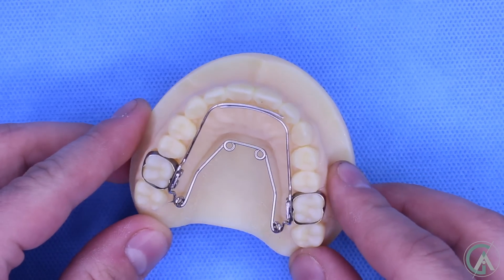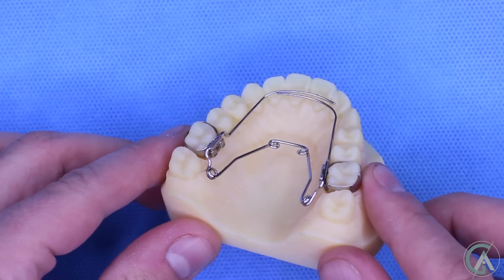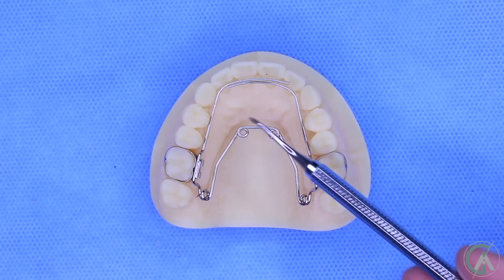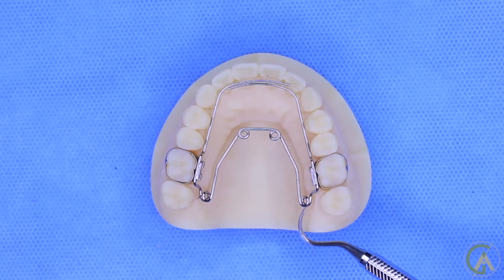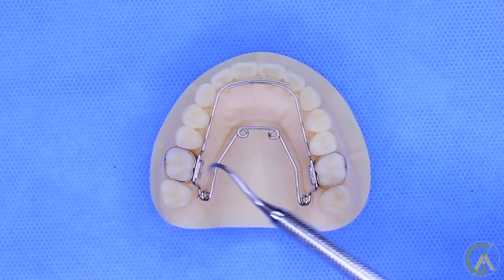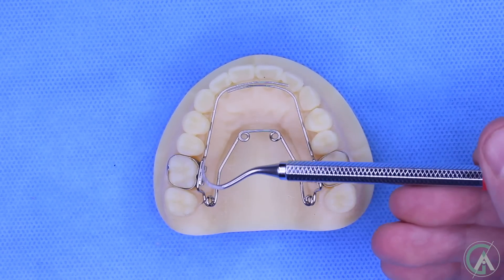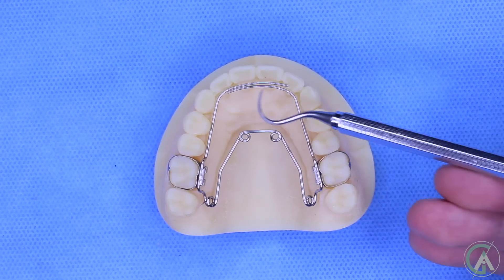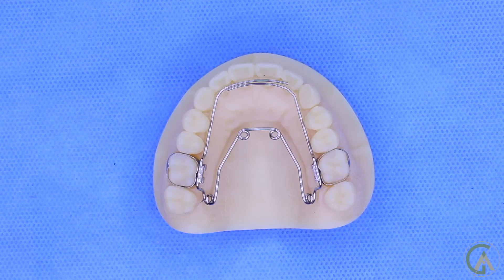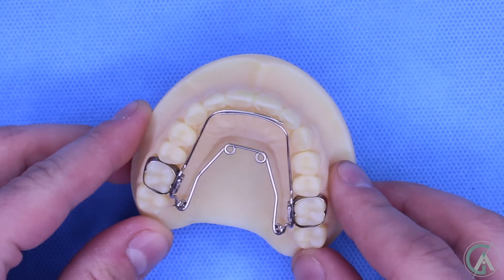This is what a quad helix expander looks like when it's actually cemented in the mouth. Thank you to AccuTech Laboratories for letting me borrow this appliance. Looking at it closely, what we can see is that there are these four circles, which are called the helixes, and they're attached to these bands either by a solder or these little slits that it can attach into. Here you can see that there are extension arms that go all the way up to the front teeth, which can be used to make the expansion a little more broad or for different uses.